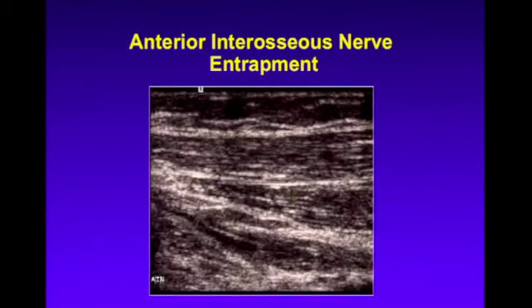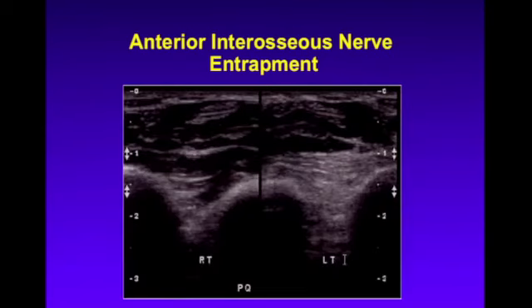Yes, occasionally you can see the nerve. This is one example where we actually could see this very small, basically a millimeter-sized nerve that suddenly came to a point here, but that's not the norm. The norm is that we're going to look for the patterns of muscle atrophy. So here is a side-to-side comparison on a split screen with the right upper extremity and the symptomatic left. When muscles atrophy, they fill with fat and they become brighter, and then they become thinner as well. But the first step is as they fill in with fat, they'll become brighter because of more interfaces.